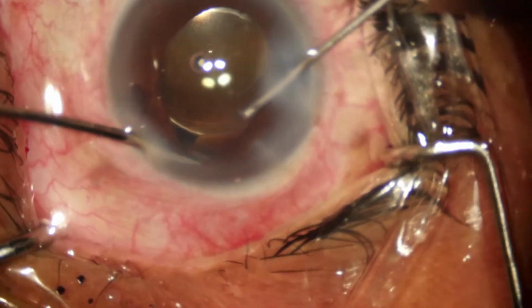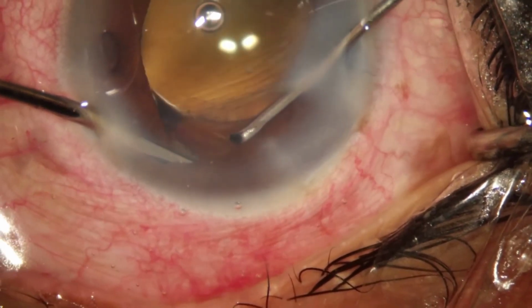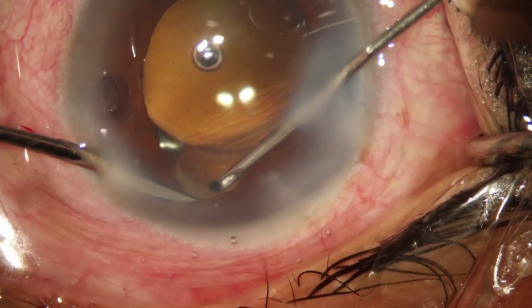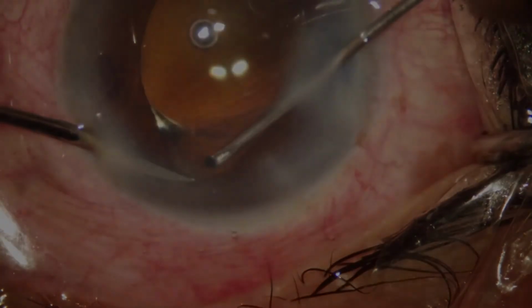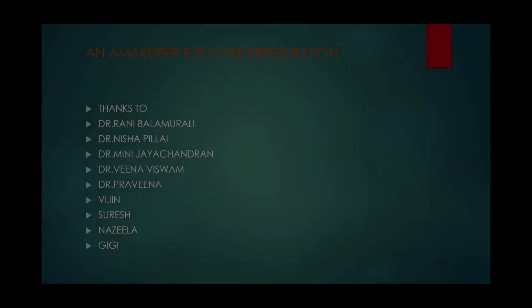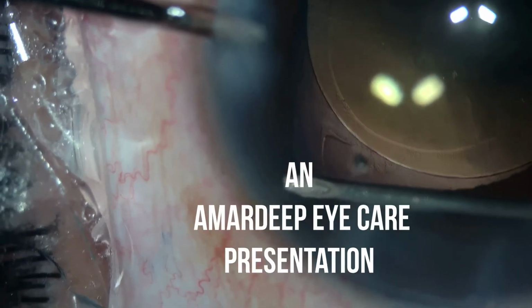An increased awareness of capsular bag distension syndrome will help the surgeon to pick up these cases and manage appropriately. Apart from complete OVD removal, a simple step of peripheral anterior capsulotomy in high-risk cases will completely eliminate it. In the current cataract surgery scenario, where there is increased emphasis on the perfect round rhexis and 360-degree overlap of the optic by the rhexis edge, we feel this simple step will be a useful tool in the surgeon's armamentarium.